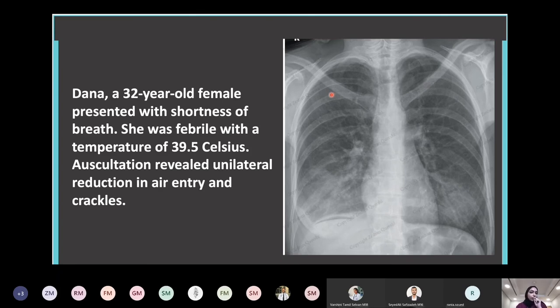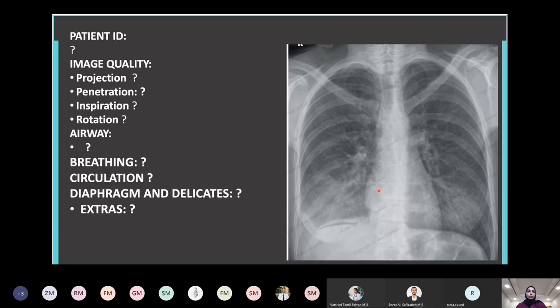One last point. So many people have this idea about x-rays. When you want your patient to take an x-ray, you have to ask him to inhale, then hold, take the x-ray, and that's how we have air, because if you're exhaling, this will probably look white. So this patient inhaled for this patient to have this image. So go through the steps, try to figure them out.